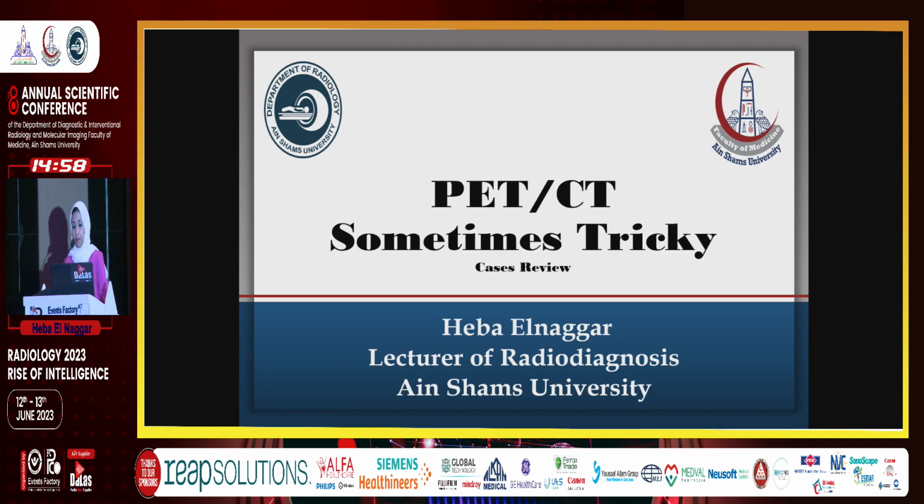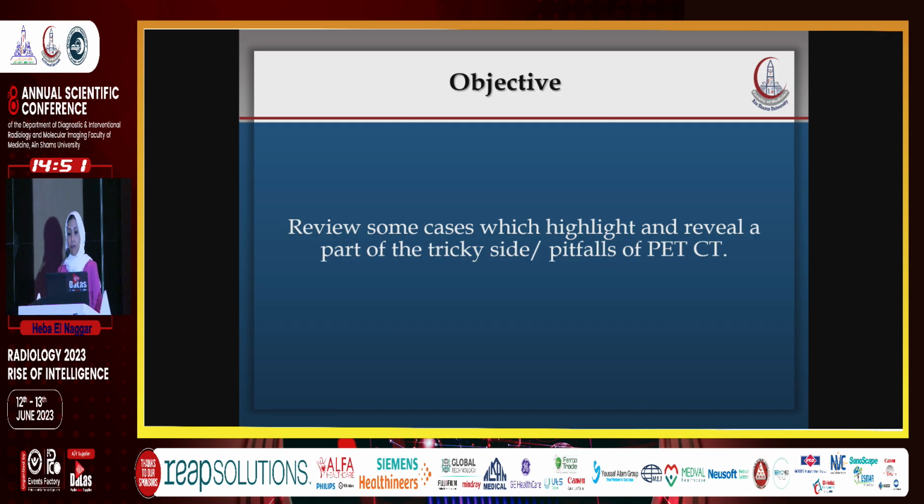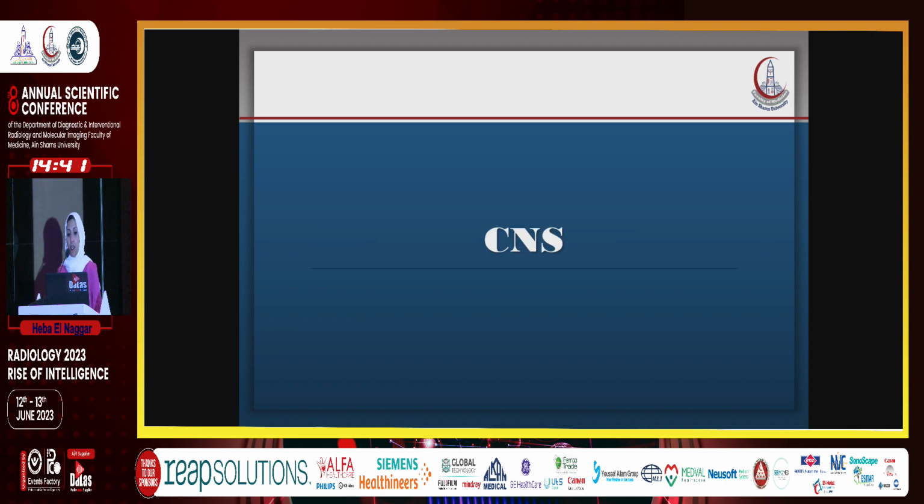Good morning, dear professors and colleagues. My talk today is about PET-CT, which is sometimes tricky. The objective of this lecture is to review some cases to highlight and reveal the tricky side and pitfalls of PET-CT. Of course, not all of them, but part of them. We'll start with the different systems of the body, and first we go with the CNS.